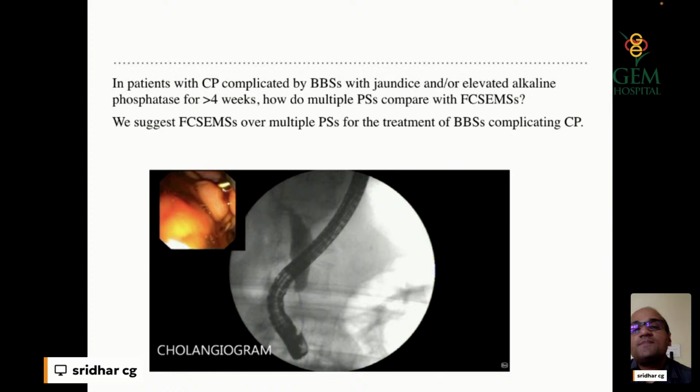In these cases, when it comes to the biliary strictures, either benign or malignant, the scientific literature for a fully covered stent or a biliary metal stent has a higher implication rather than plastic stents, which requires multiple sittings. And one important thing is we have to rule out a malignancy in these settings. And without ruling out a malignancy through a brush cytology or an EUS FNA, don't rush in to place any stents because the whole image gets disturbed.